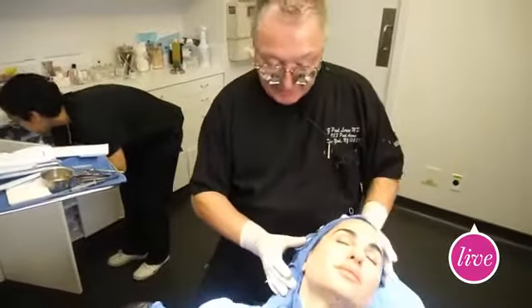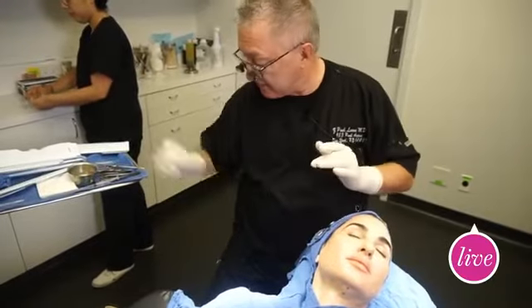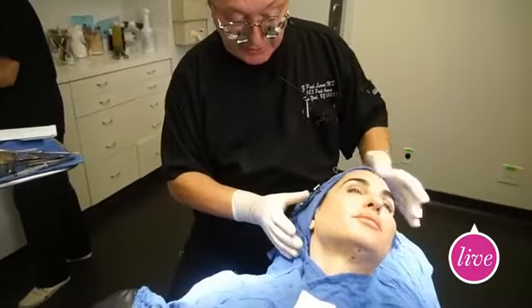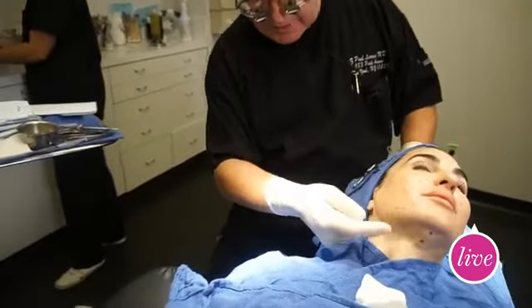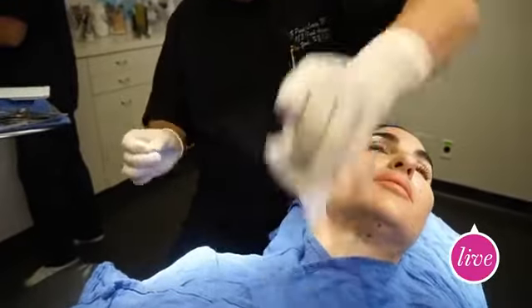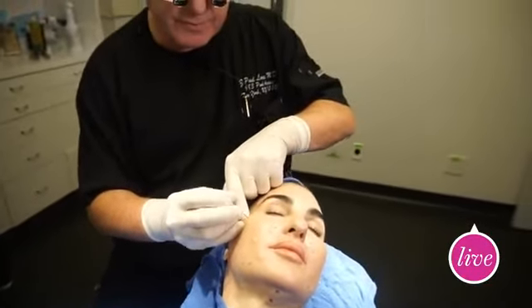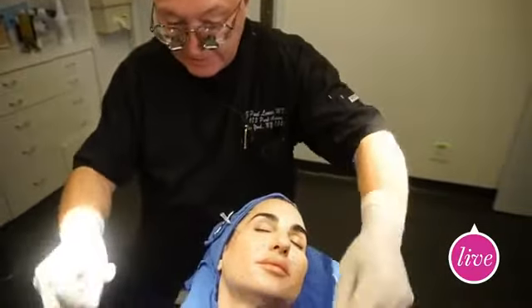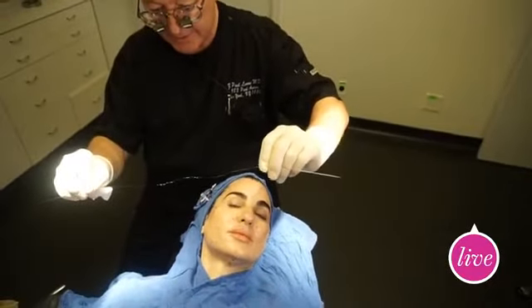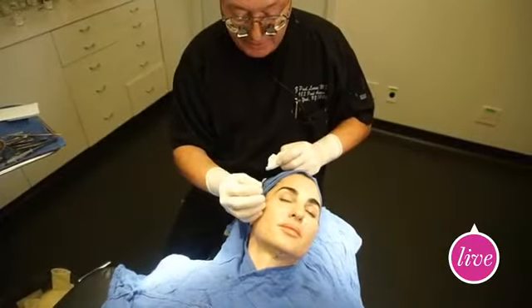So what we did is we prepped the face. Of course, this is a sterile procedure, and it should be treated as such. I also marked the entrance points, which are right here. We're placing 6 sutures on this side and 6 sutures on the other side, and then the exit points you can see. Everything has been numbed up with a local anesthetic, and the first step is really just making the entrance for the suture. So I use a specific needle. The suture, as you can see, has these little cones on it with knots in between to hold it in place. The first step I do is just to tie down the knots so they don't slide anymore.